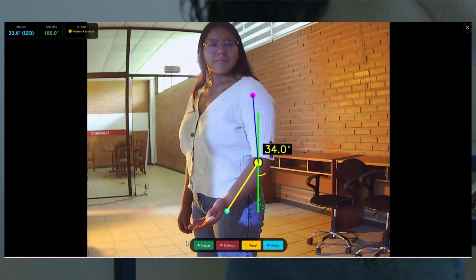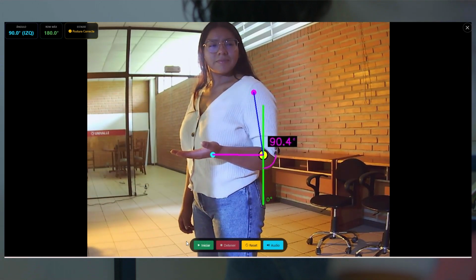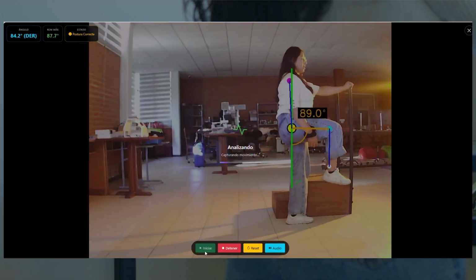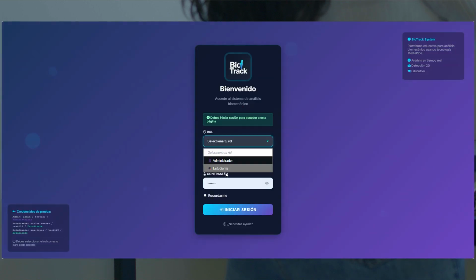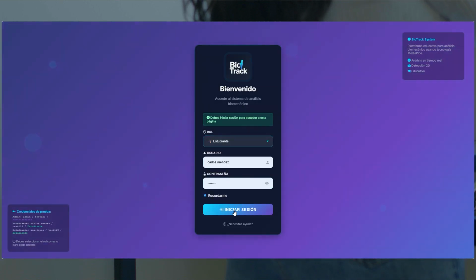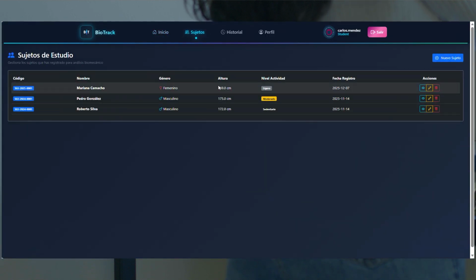Processing is done frame by frame, depending on the exercise selected. The system defines which articulations to analyze and which landmarks to use. MediaPipe Pose detects 33 anatomical points per frame, approximately 30 times per second. With these points, we construct vectors between body segments and calculate the instantaneous angle using vector trigonometry, dot product, and arccosine. The angle is transmitted in real time to the browser, while the session is logged in the database.